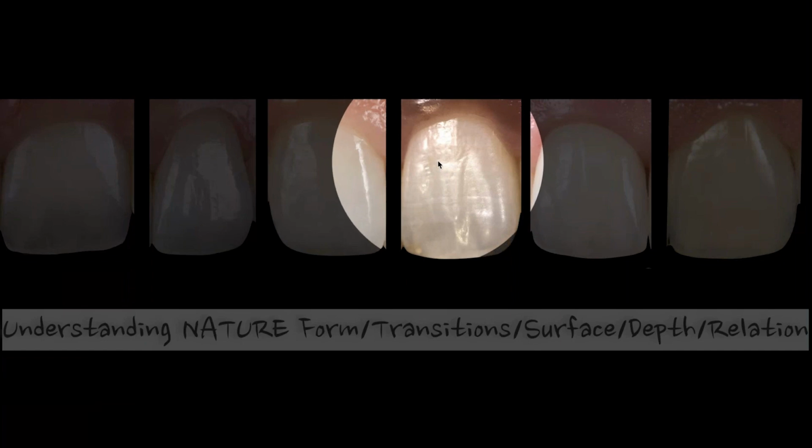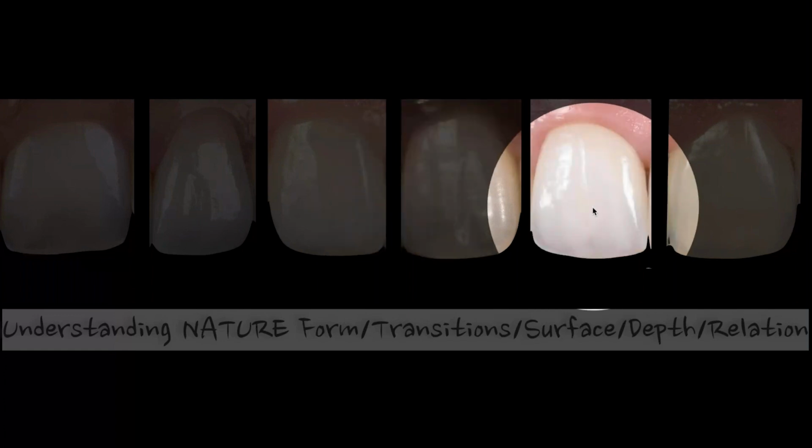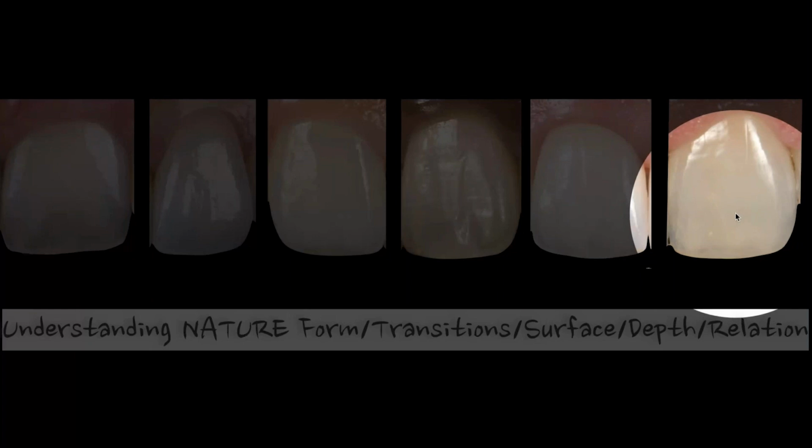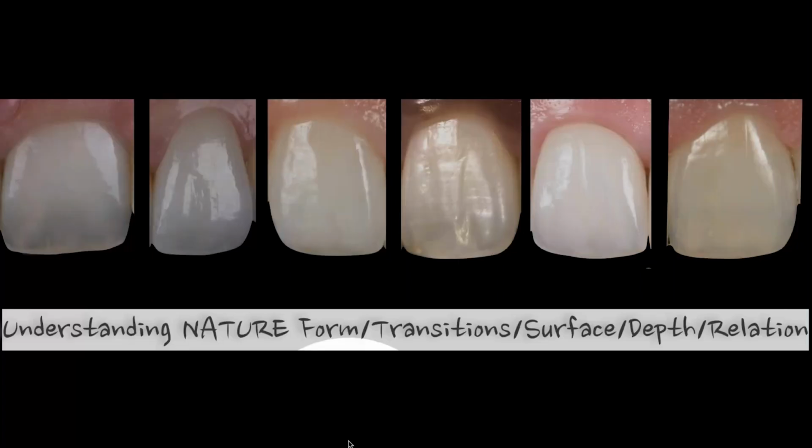Do they all have to be exactly the same? No. They just have to blend and reflect light similar. Okay, the obvious fake one that you guys picked out. And then the last one here, again, much harder to match a case like this because of maybe the age of the tooth and the softness of some of those, some of the topography on the surface.